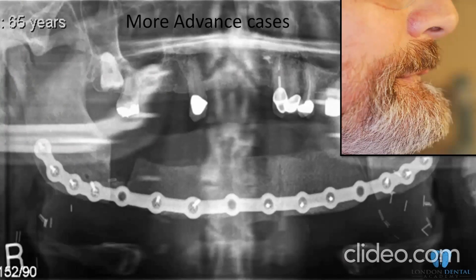I think this is a more advanced case, mandibular resection done due to cancer of the floor of the mouth, and as you can see, from angle to angle, reconstructed with 2 DCIA flaps. As you can see, there is a big space, and we're expecting this to heal within 6 to 12 months' time, but we can't do anything at the early stages because we don't want to overload this load-bearing plate.